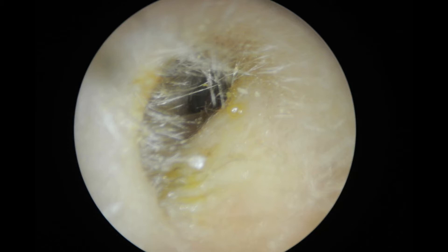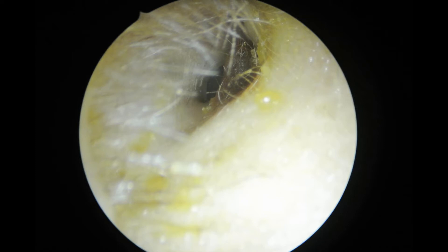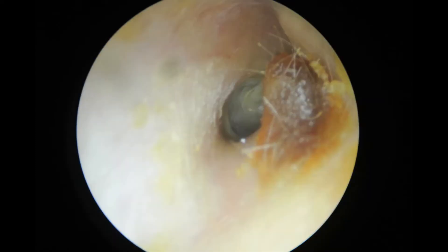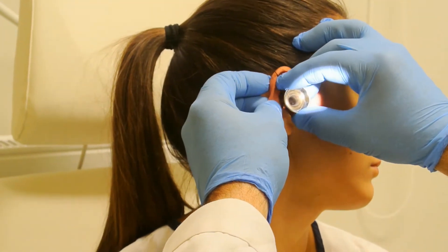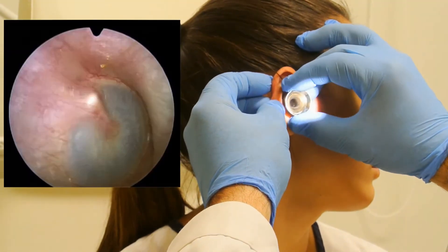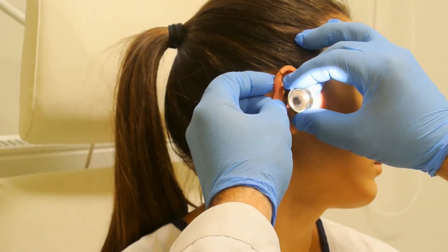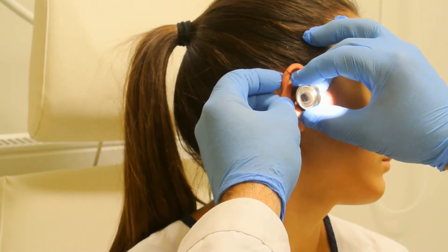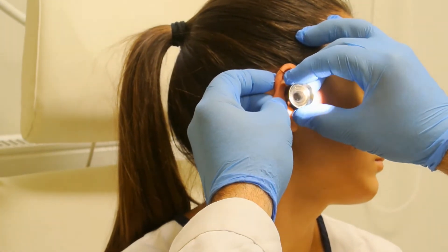We should examine the ear canal. The funnel will straighten the ear canal so we can examine the deeper part of the external ear, and we should also check the tympanic membrane. We should not introduce the funnel too deep as it can cause pain for the patient.